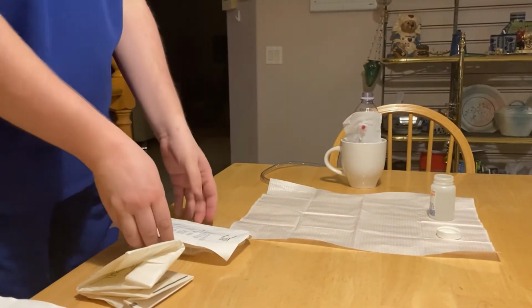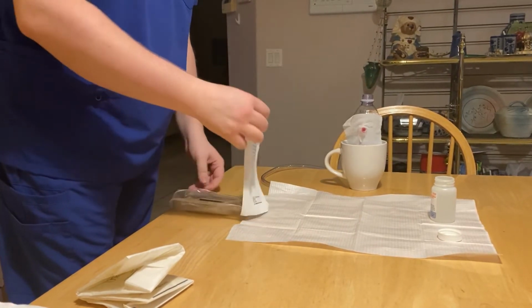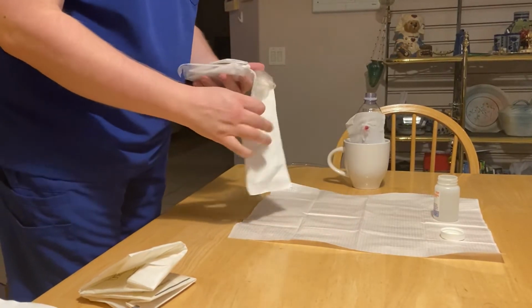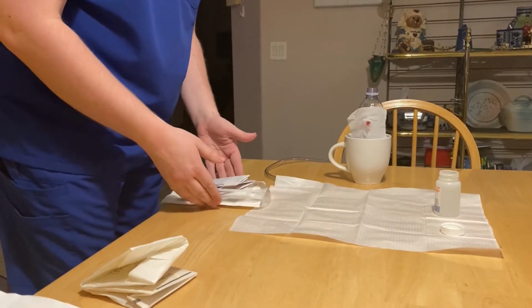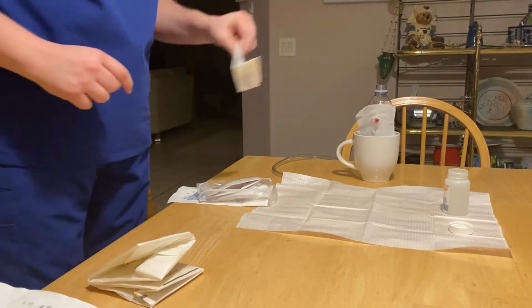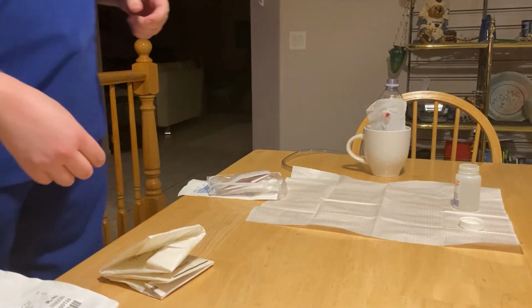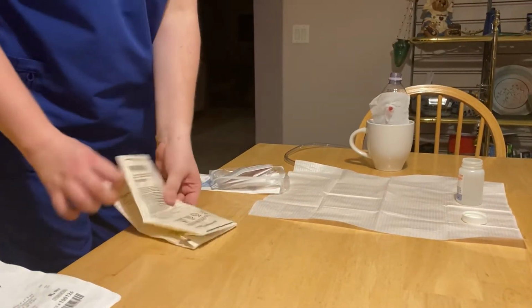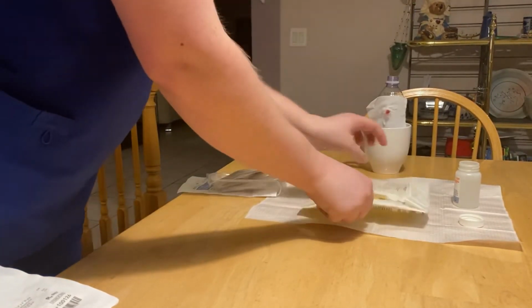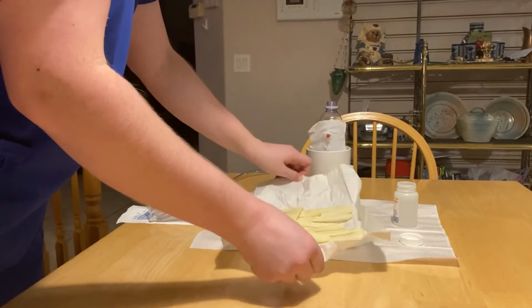Grab my tracheotomy suction kit. I would then open it away from me. I would then take out my sterile gloves. That is the only thing I can touch in here. I'm going to be using my own, so I'm just going to move these ones off to my side. The next thing I would do is get these out. Open them up.